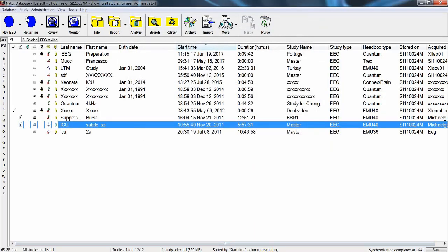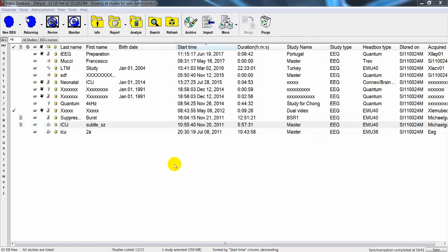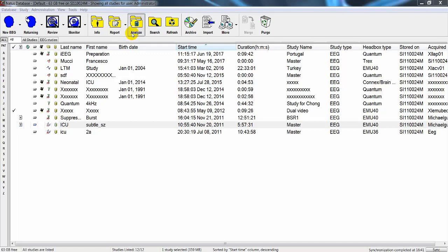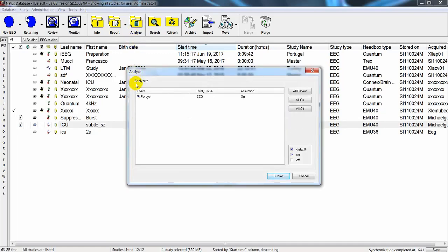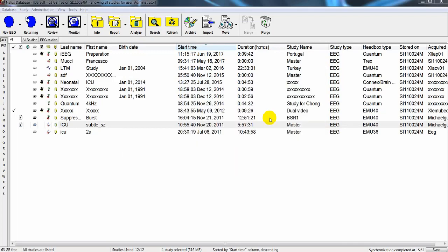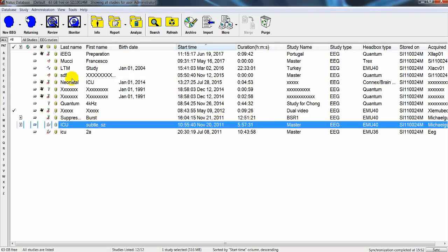To run the analysis, select the study and click on Analyze. Check the box with the blue check mark and click Submit. Since this study has a long duration, the process will take too long, so I will skip the process and directly open the study in review mode by selecting the study and clicking Review.